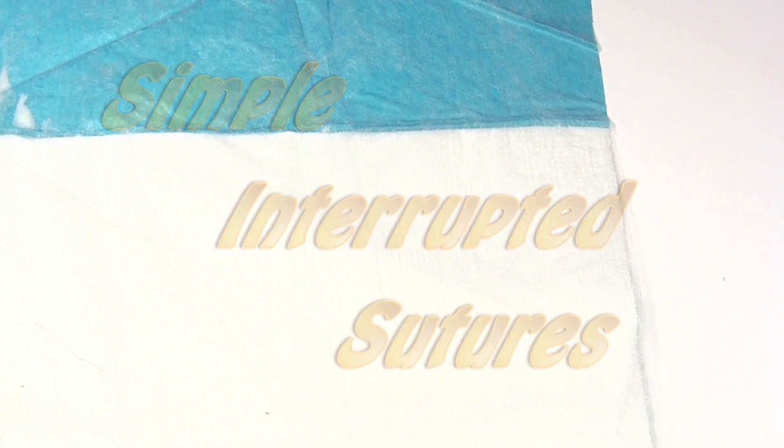Let's talk suturing. This video is going to be on simple interrupted sutures, which are the most basic kind of suture — the ones that most people think of when they think of sutures.